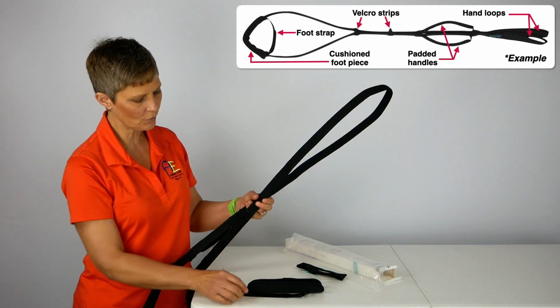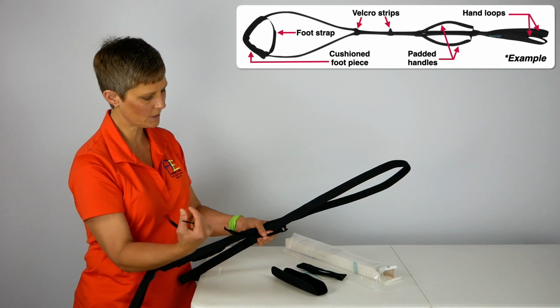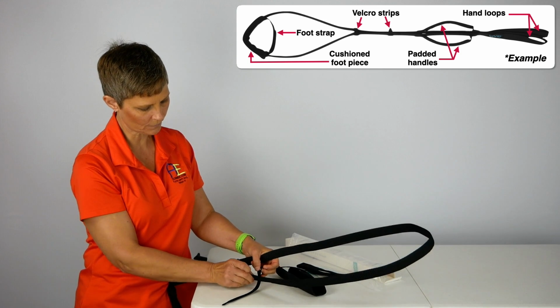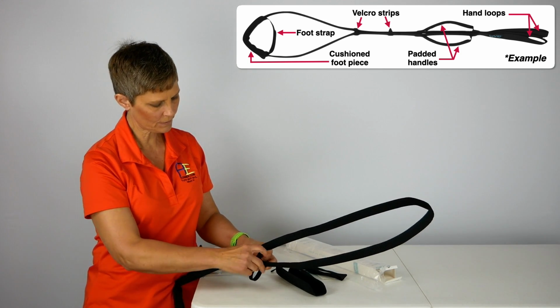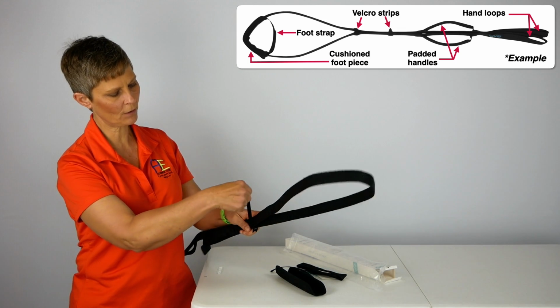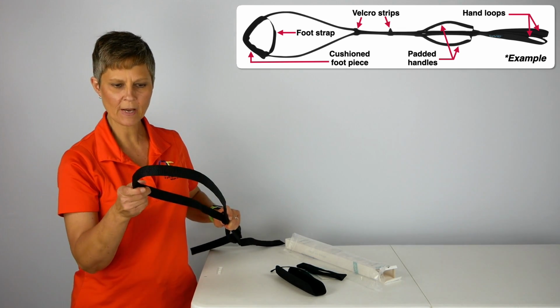So what I'm going to do with one of these pieces of Velcro is I'm just going to put it up here at the top to hold this together. So I'm just going to wrap it around the side here, just like this. Pull that through. And then I'm going to attach this piece so that it holds it closed for me a minute. Okay, so now we've got that.